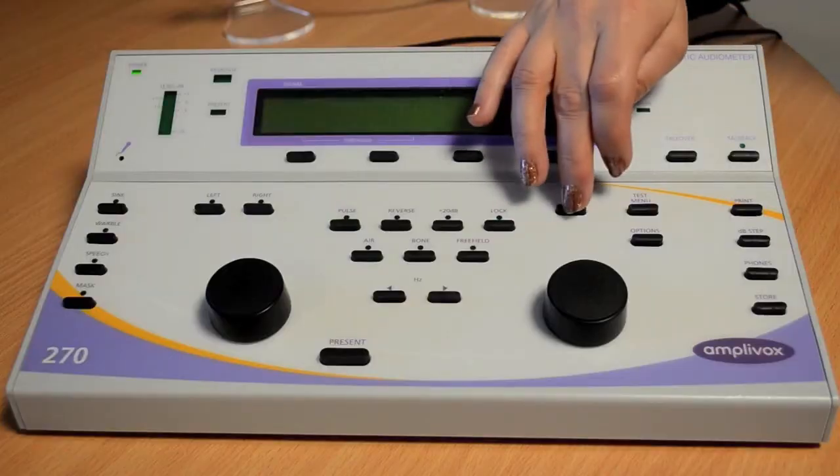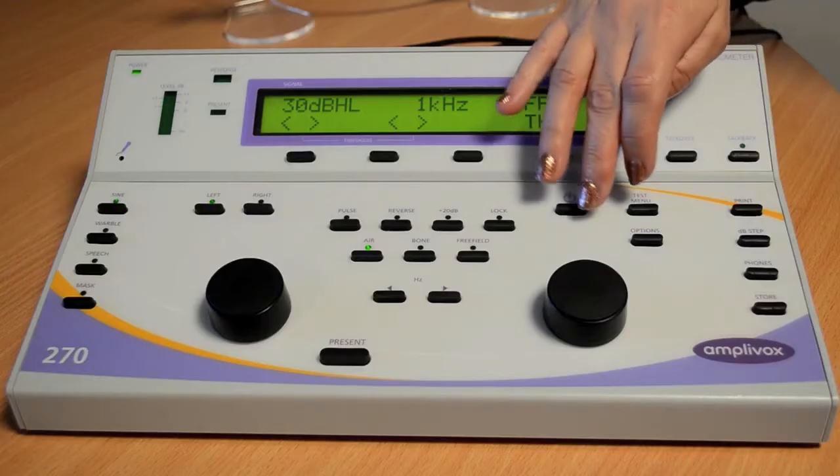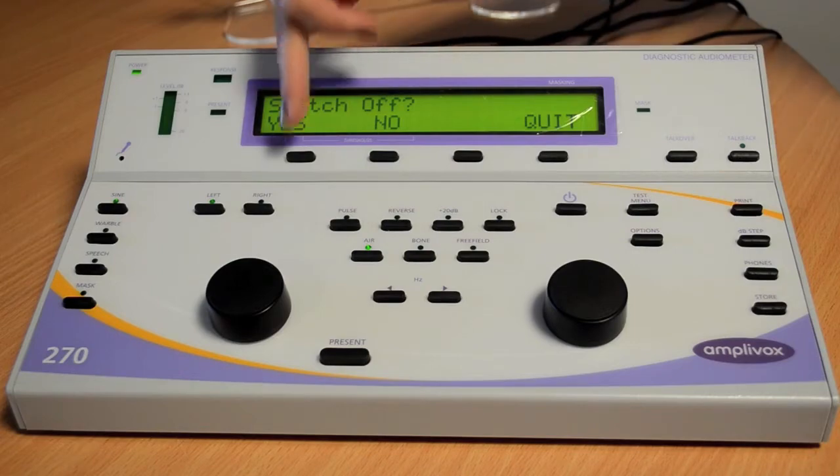To turn the Amplivox 270 on, press the power button on the machine. If you want to switch the 270 off, press the power key again and then it will ask you, are you sure you want to switch off?